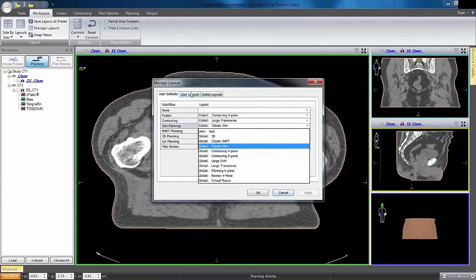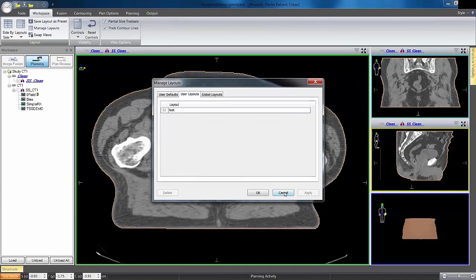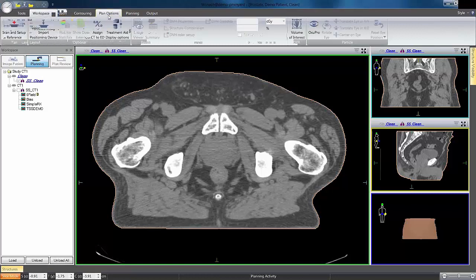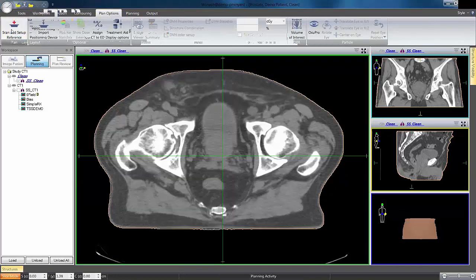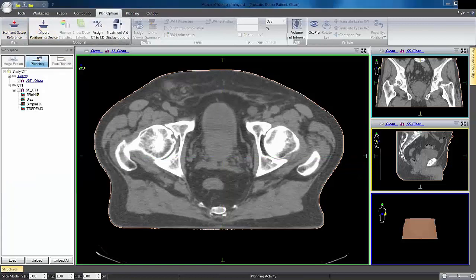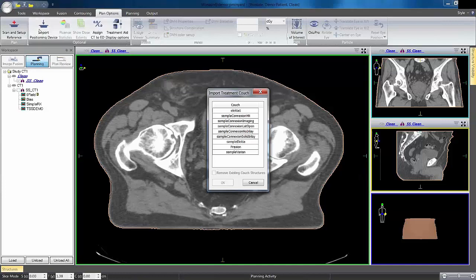We also have tabs at the bottom and along the side—another way to put tools right in front of you without taking away from the view. They expand and compress when you mouse over them. The workspace is highly configurable, with a number of layouts available depending on your workflow, and you can also create your own. We've got fusion tools, plan options, and if you don't set the ISO at time of CT, it's easy to send shifts to the therapist. You can also include the table in your calculation.